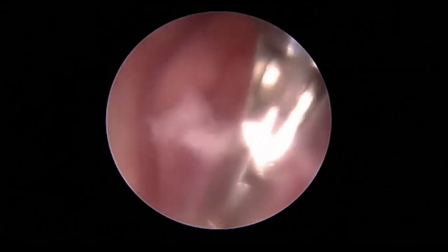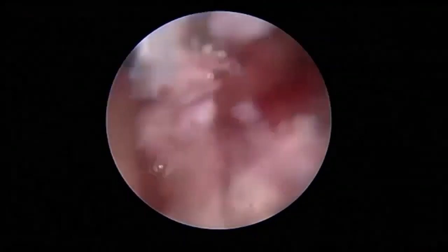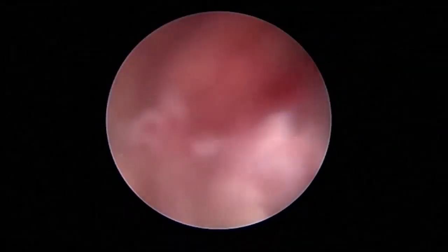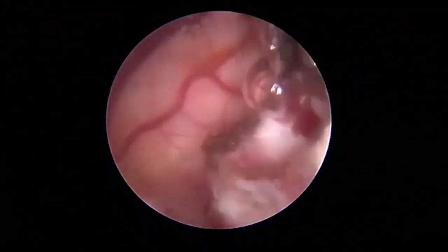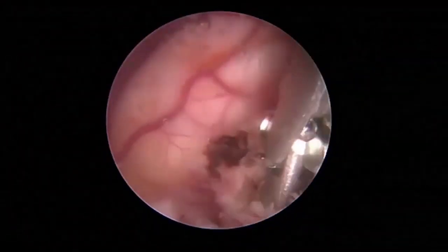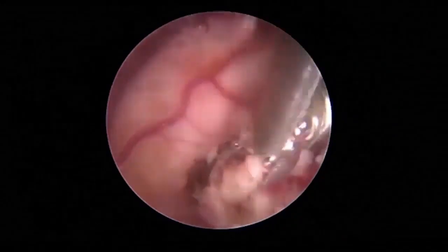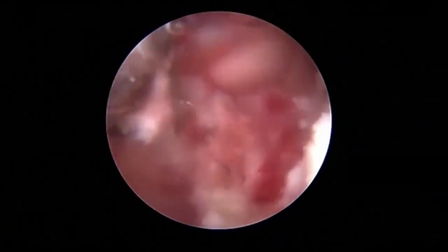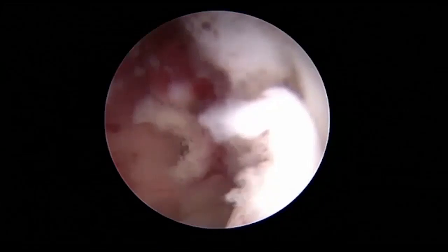Now we're working along the lateral side, the right lateral side, where you see the attachment at the caudate, which is relatively vascular, and a stepwise approach here, combination of piecemeal removal and bipolar. Once again, removing portions of the tumor in this location. And you can see the consistency of the tumor, pink, fleshy, relatively vascular. Very classic for a subependymal giant cell astrocytoma.